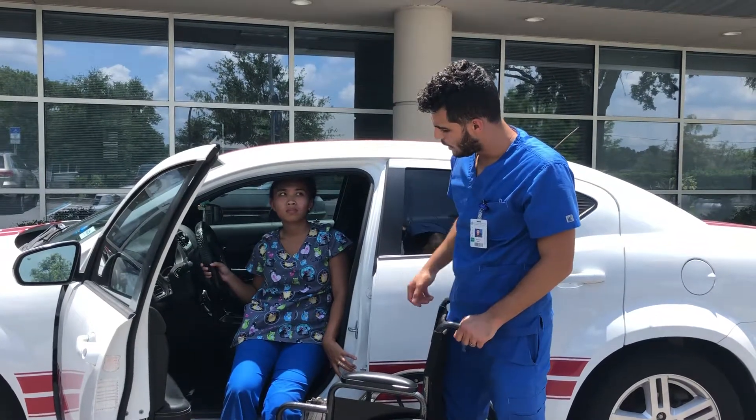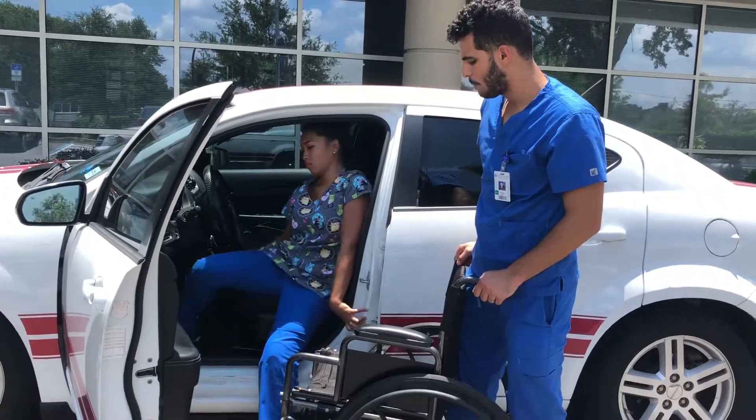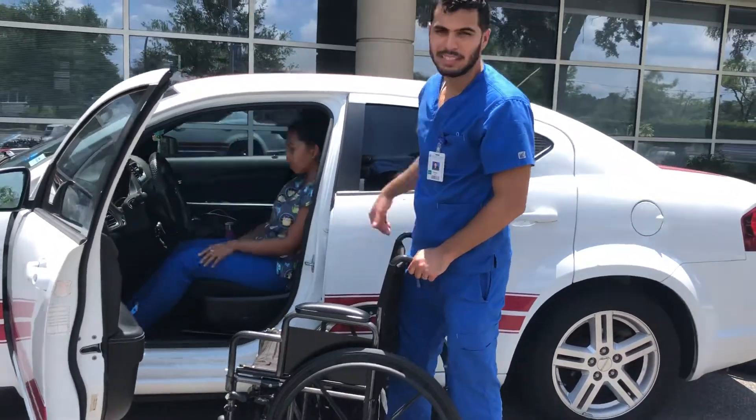From here, go ahead and grab the right leg and put it inside the car. Then grab the left leg and put it inside the car. And she's in.